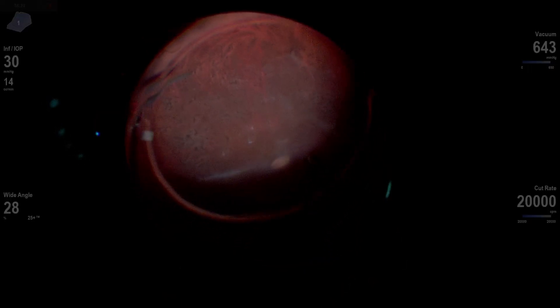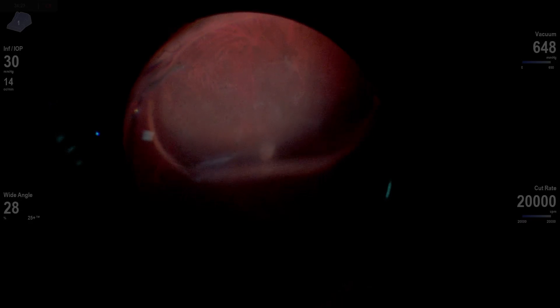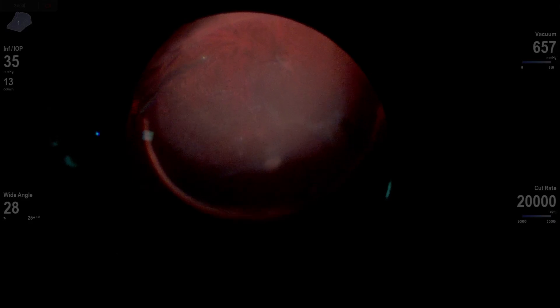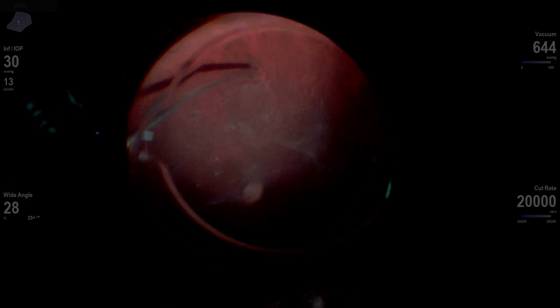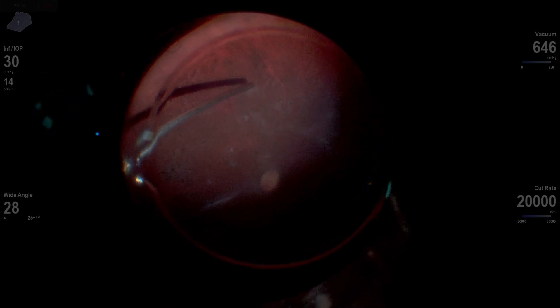I'm going to move around. If I get stuck in one spot and things aren't going as quickly or in the direction I want, I just move and continually stay active in the eye, but in a purposeful way. I'm trying to do peripheral vitrectomy, and I found that this inferior area is my best area.